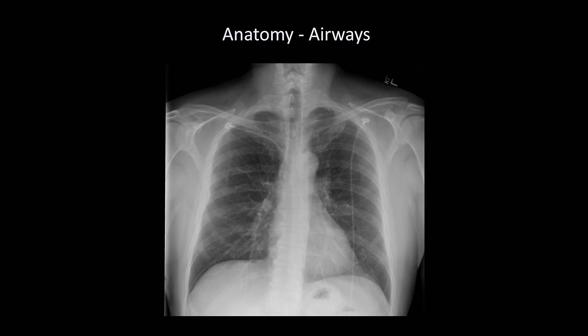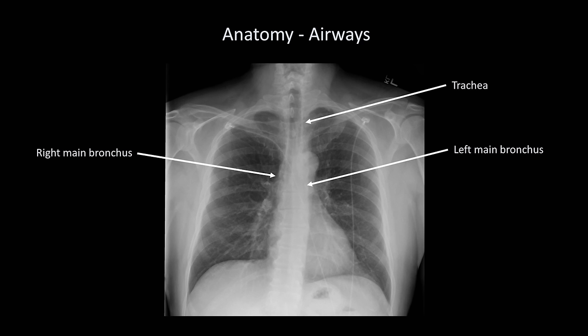A is for the airways. There are three anatomic airway structures that are typically visible on a normal x-ray: the trachea, which is normally in the midline, and the right and left main bronchus. Remember that the patient's right will be on the left side of the screen. The left main bronchus tends to take off from the trachea at a slightly more horizontal angle compared to the right, which is why aspirated foreign bodies, if small enough, are more likely to end up in the right lung. It's also why endotracheal tubes, if advanced too far, end up in the right main bronchus, blocking off ventilation to the left.